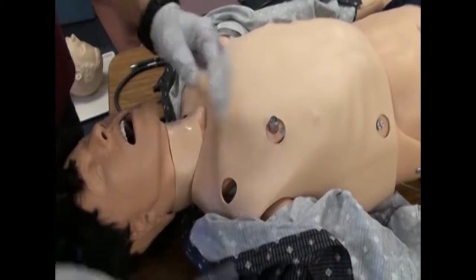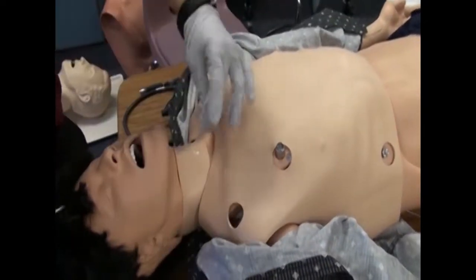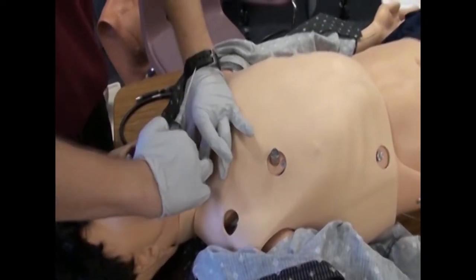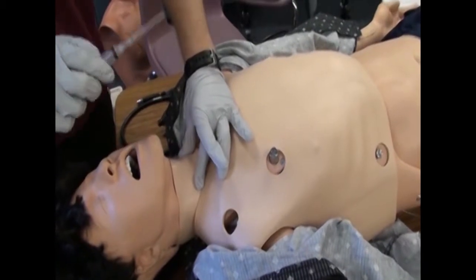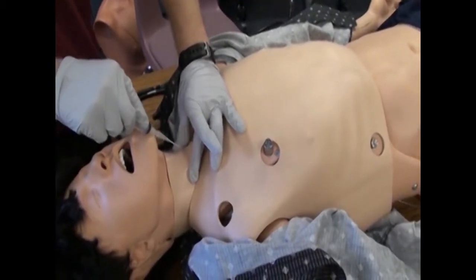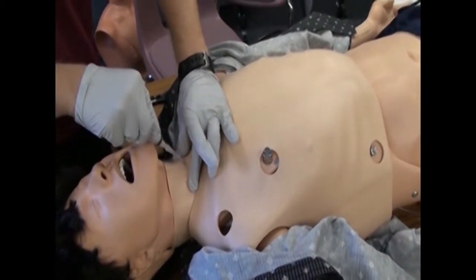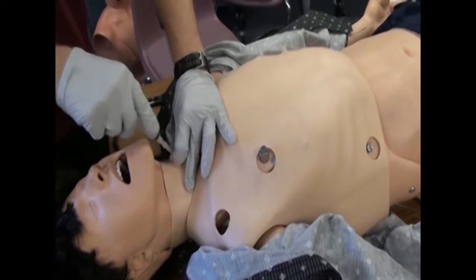Inserts the needle on the syringe down through the midline of the membrane at a 45 to 60 degree angle. Applies negative pressure to the syringe during insertion until air is aspirated.